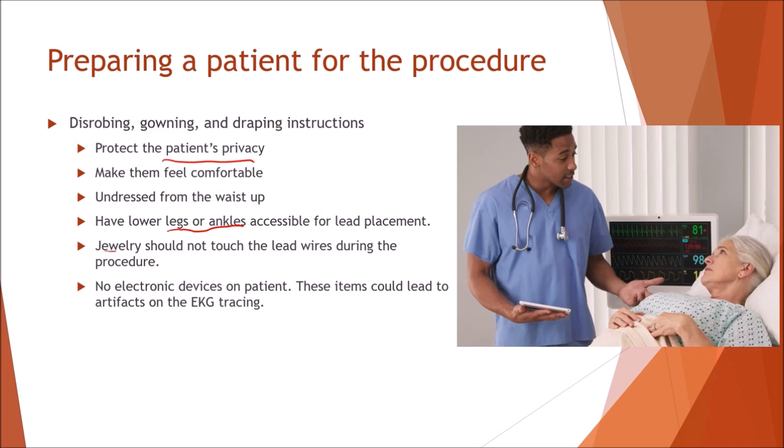If they have any jewelry that's going to be touching the electrode, you want to make sure that they take it off, because if they have it on, it's going to create interference. And this one's really important. They should have no electrical devices on them, because that would also create interference, also known as artifacts. That's going to mess up your whole image, and you're going to have to retake it.